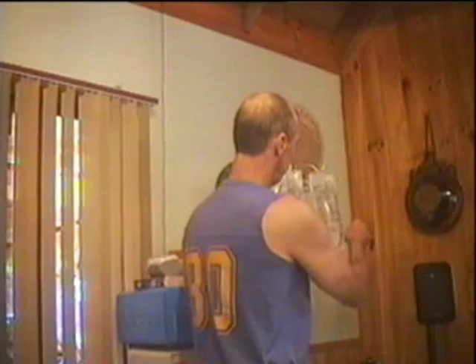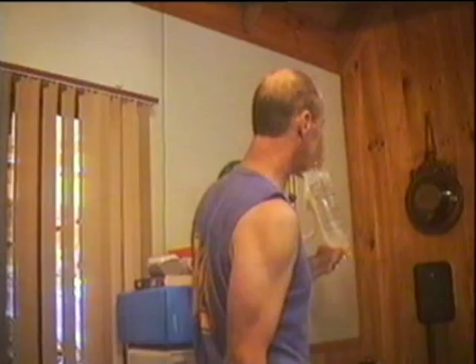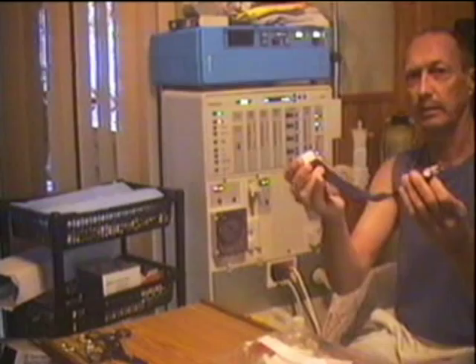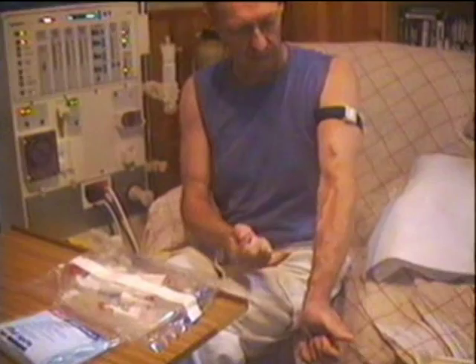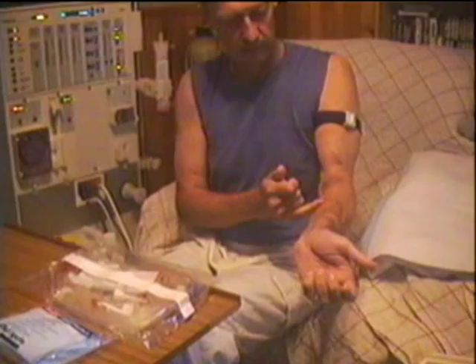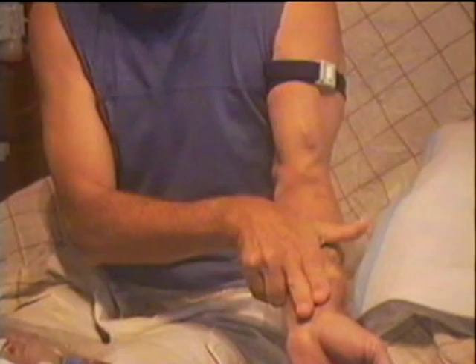I'll take the seals off the end of the saline bags — don't touch the end of those. Now, you have a tourniquet. I'll just put that on my arm. I use two points on my arm. As you can see, all my veins are fairly swollen up over the years. They attach to veins inside your arm to increase the flow, which makes the vein get larger over time.